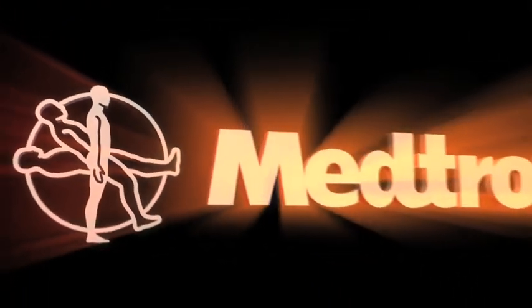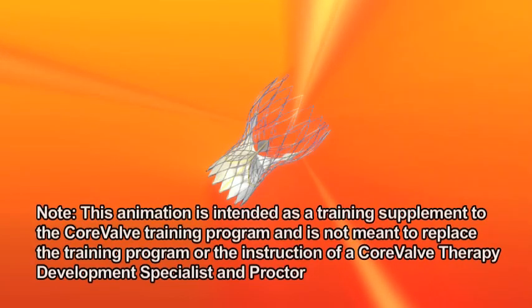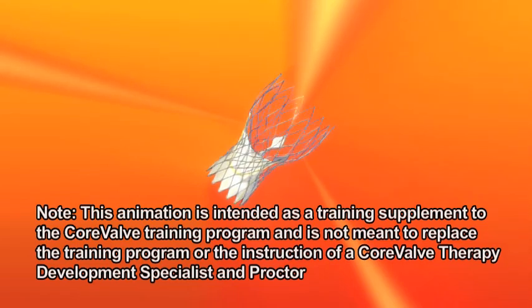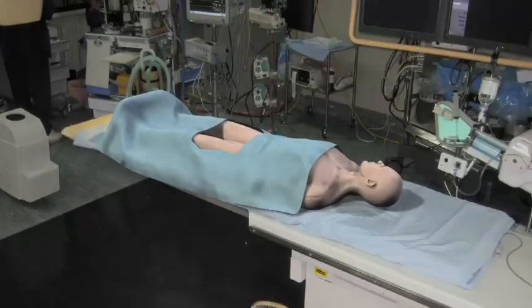This presentation is a step-by-step guide to performing the Medtronic CoreValve percutaneous aortic valve replacement procedure using the CoreValve system. Note, this animation is intended as a training supplement to the CoreValve training program and is not meant to replace the training program or the instruction of a CoreValve therapy development specialist and proctor.